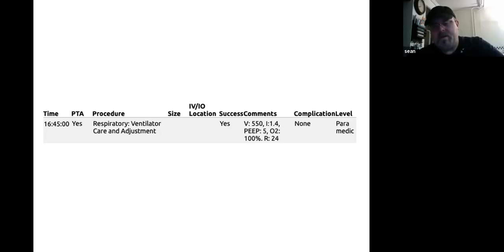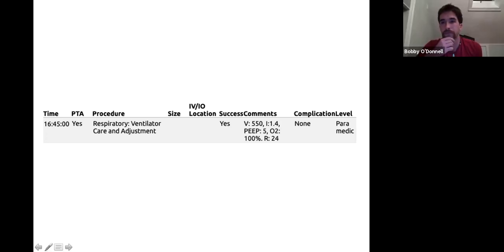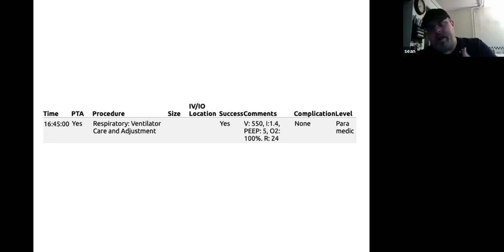Bobby, I have a question. Yes. So with the things that you guys want put into TEMSIS, can you create just a worksheet so that it prompts us? I'll be honest, I'm going to be like, yeah, I changed it. I'm not even going to probably tell you what I changed it to. You know what I mean?